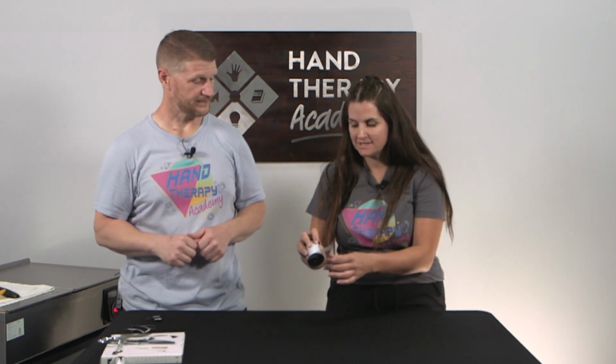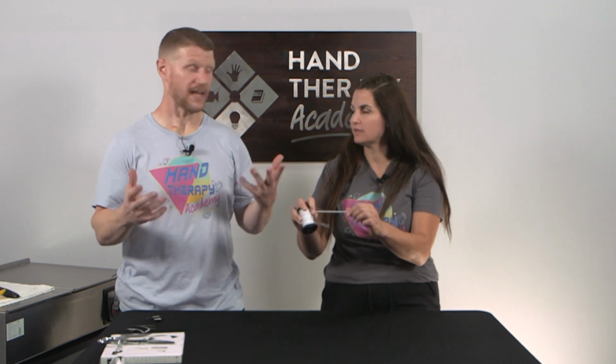For this radial palsy version, I like using this. It just adds a little bit extra stability and it loops through. There's other versions of it, lots of different ways to make the splint, but we're going to use this today. So let's see if that splint's ready. And I'd also say with this, you can find similar stuff to this at like Joann's. So yeah, it just depends. If you don't have it right away, you can go to Joann's and get it. They kind of have different cables and different diameters. Perfect.